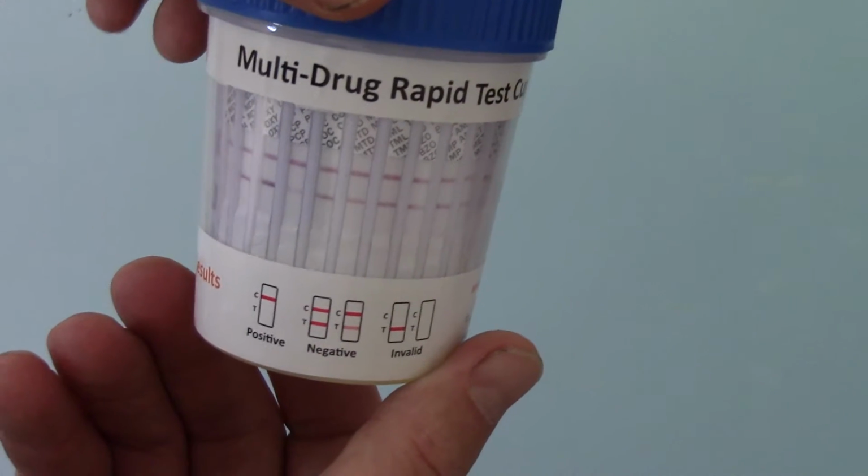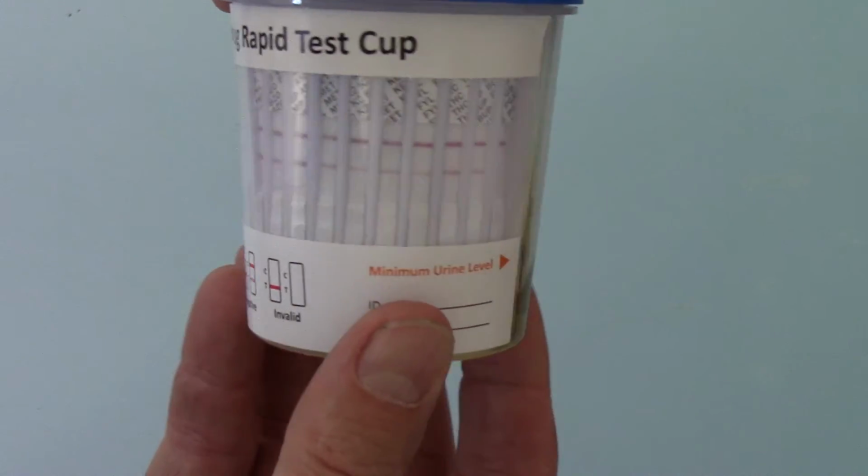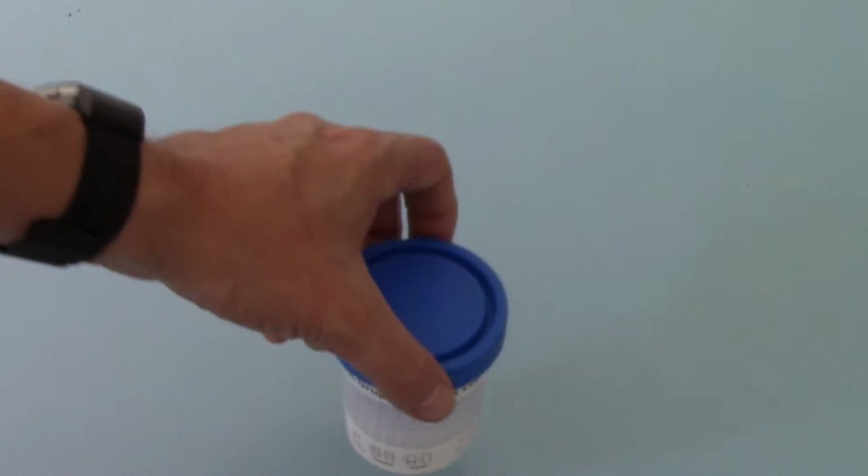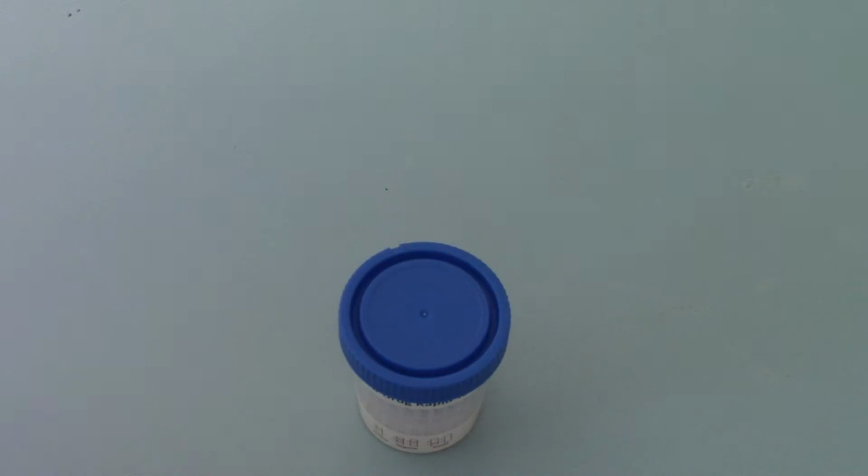And then after that, you do not come back to it and look if any other lines have formed beyond that. The correct result is the result that is showing at the read time for that drug group. So what I'm going to do with that is now leave it for a full 5 to 10 minutes, and then we will interpret the results that we've got from that urine sample.